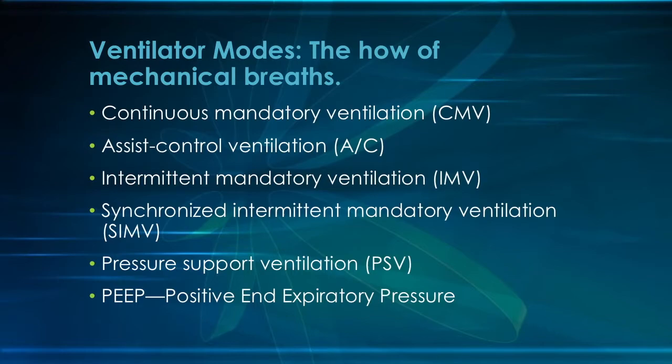Both of them allow your patient to breathe on their own, with you setting the preset and the rate. But if anything happens to where they're not breathing enough, your ventilator will kick in and do the work for them to the presets.